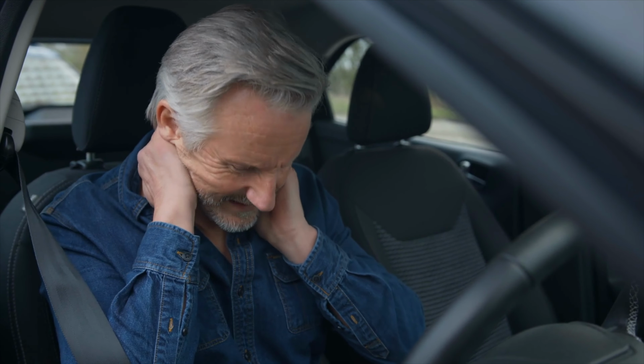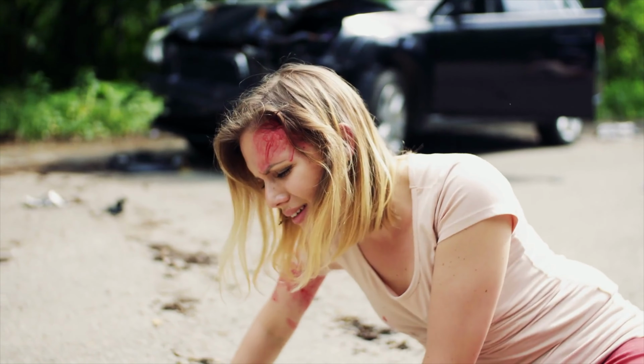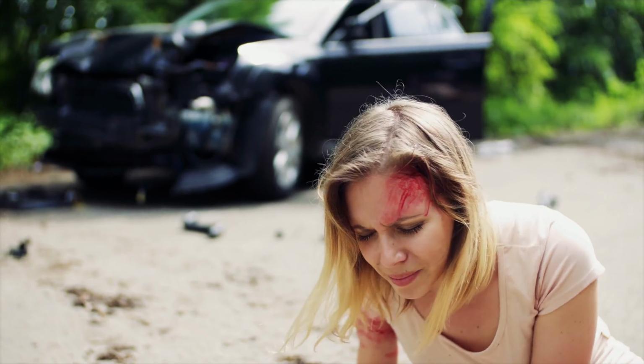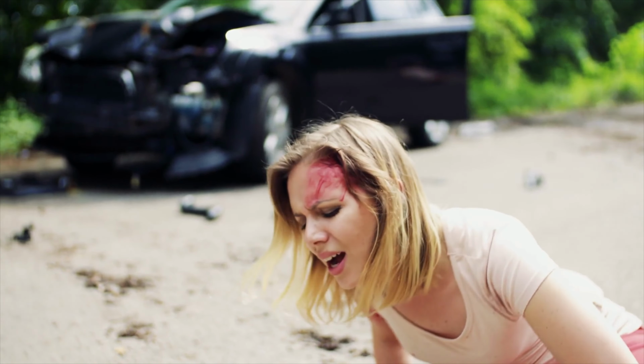Your patient should still be inside their vehicle. If your patient has exited the vehicle prior to your arrival, then the KED is no longer appropriate, and a different immobilization technique should be utilized if warranted.